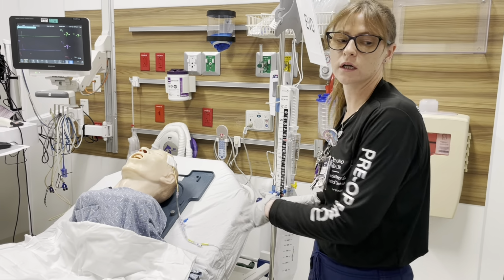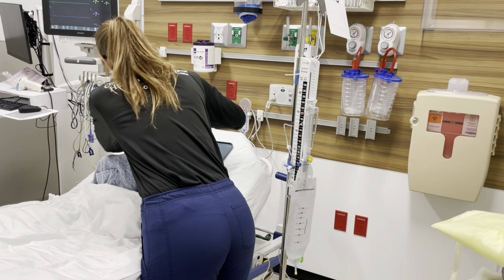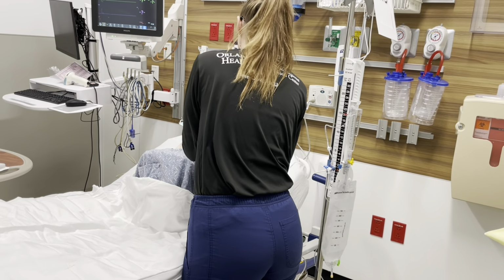So we will put this on him. I'm not sure how well it will stay. Oh, he's got some good ears. It'll stay.